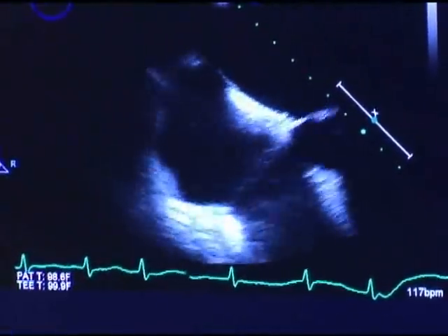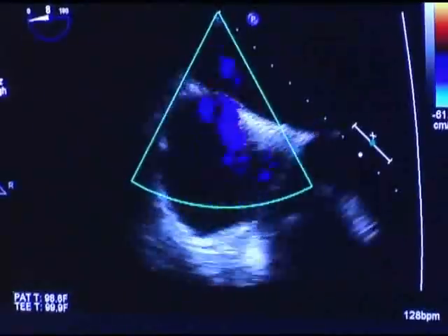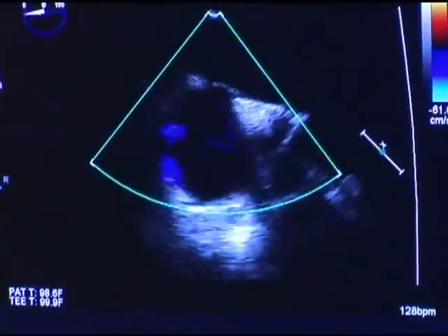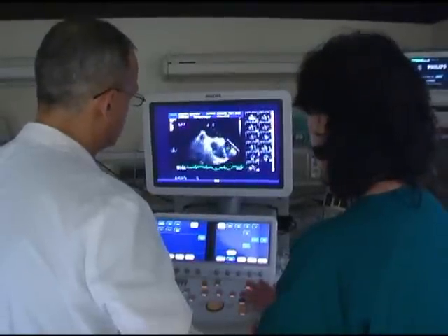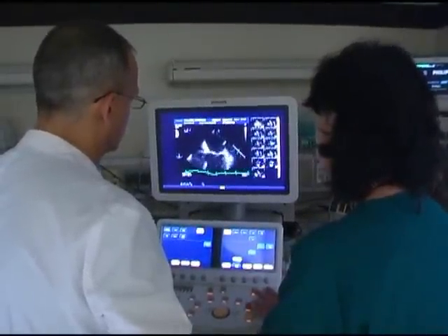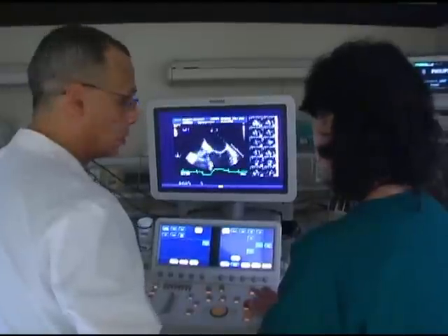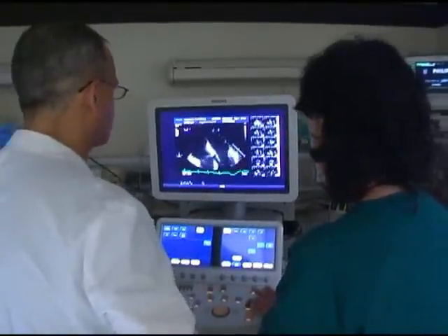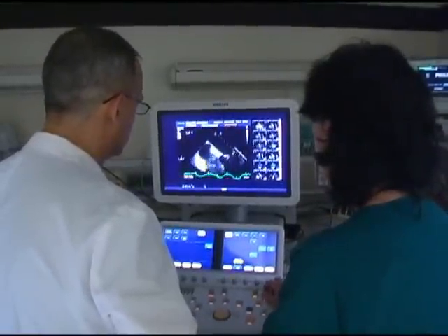Let's put color flow over the atrial septum, and we're doing that to see if there's any congenital abnormalities like a hole in a membrane. My first impression so far, on this initial view, is that there's no clots, which is precisely what we're looking for, so that we can then proceed to the next procedure that we have planned for the patient today.